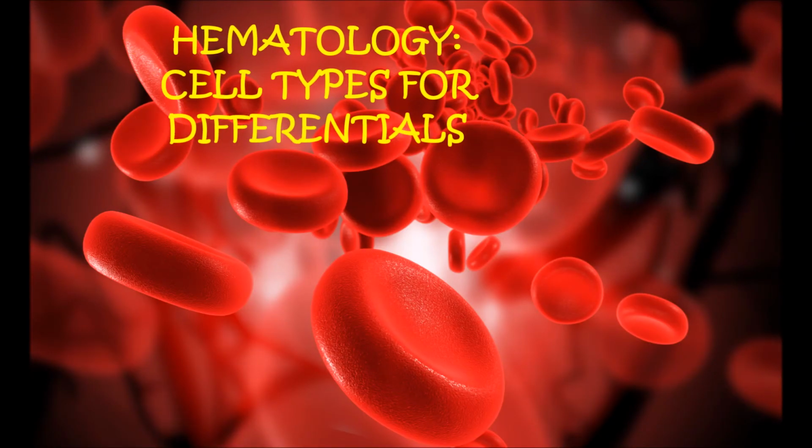Today's topic is going to be hematology cell types for differentials. So essentially we're going to be talking about diffs and cellular morphology, what that entails and what you need to know about it, and how you can identify various types of blood cells: red cells, white cells and platelets alike.